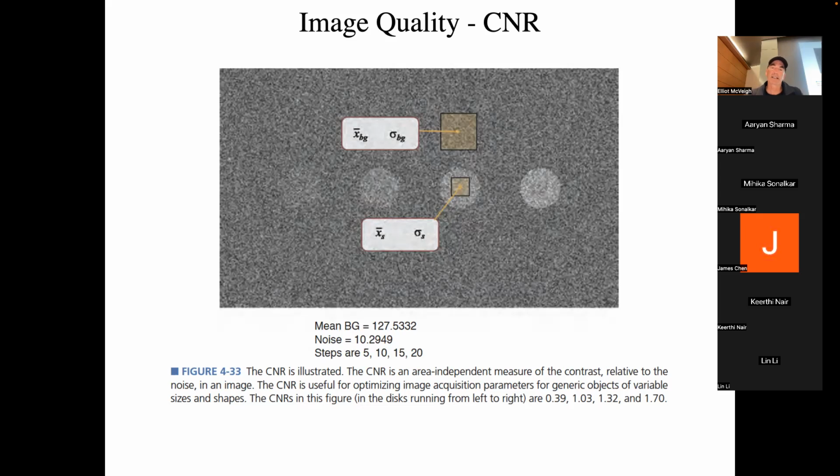So we started looking at image quality in the context of how data is obtained with computed tomography. And I just want to review a very simple notion of signal to noise. And that is, if we have an image in which the noise is uniform over the field of view, we can just draw a boundary or a region of interest, say, 100 by 100 pixels. So you have 10,000 estimates of signal level inside here.